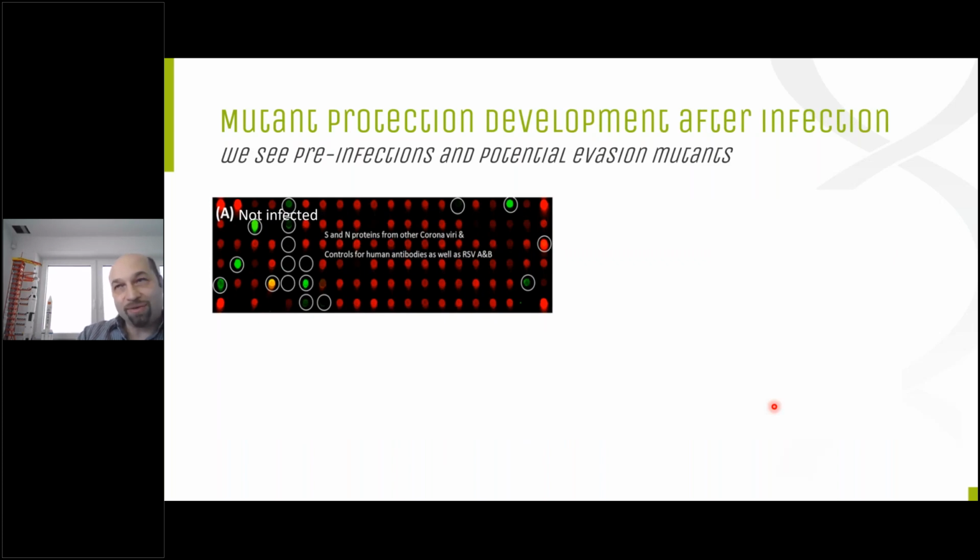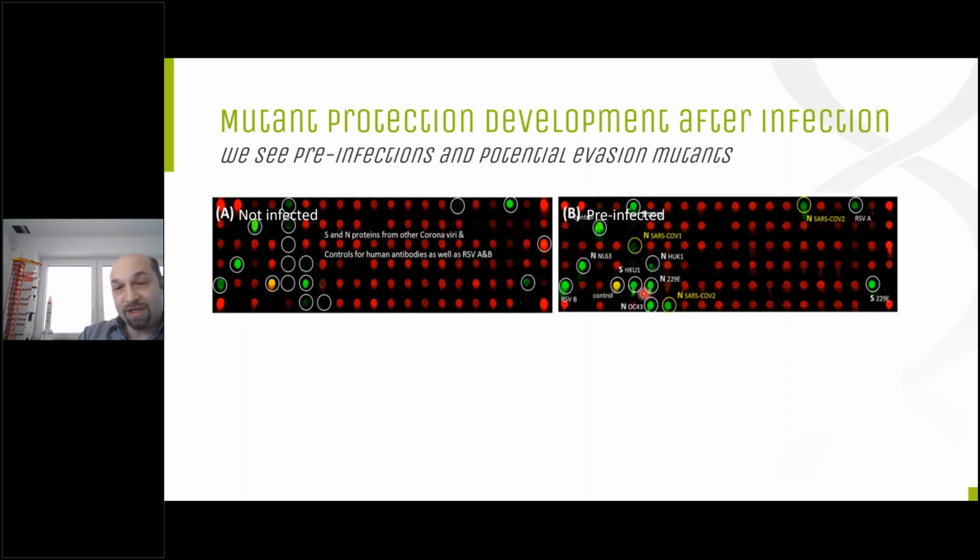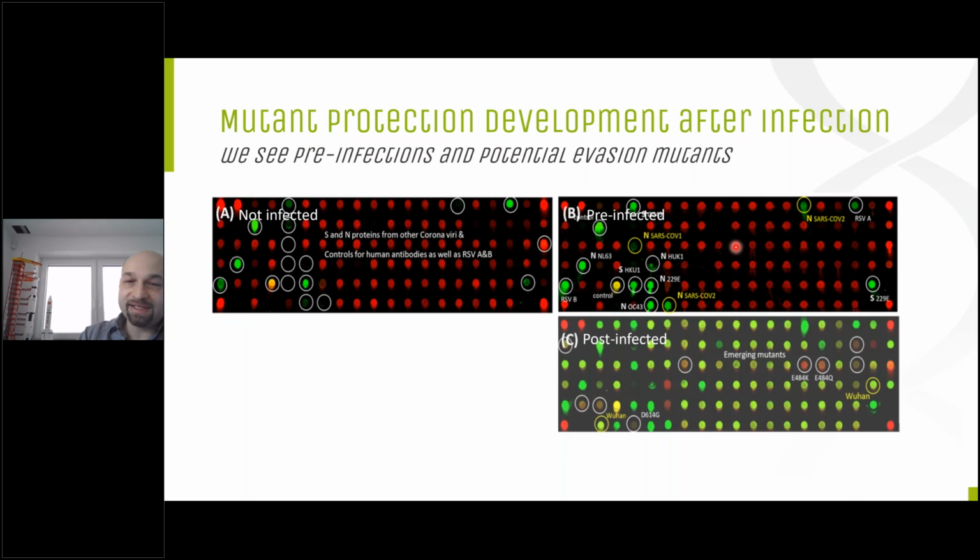As we have all the other coronaviruses on the surface, you can directly read out the pre-infection of the persons. You can see this person here, for example, was not so much in contact with different other coronaviruses, whilst this person was. And astonishingly, we see quite often if the persons have a lot of contact with different other coronaviruses, they still have no S protein protection, but they have some cross-reactive antibodies with the N protein of SARS-CoV-1 and SARS-CoV-2. And at the moment, it is speculated if such persons have a more severe progression of the disease, because it may be that the immune system simply tracks down first the N proteins and doesn't build up so easily the protective S proteins. But this is pure speculation.